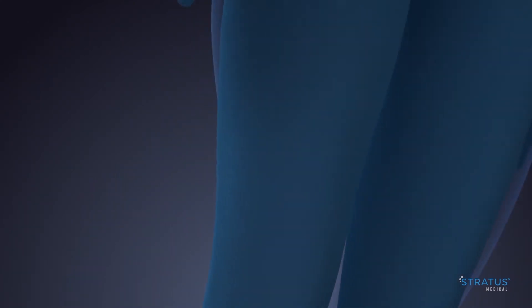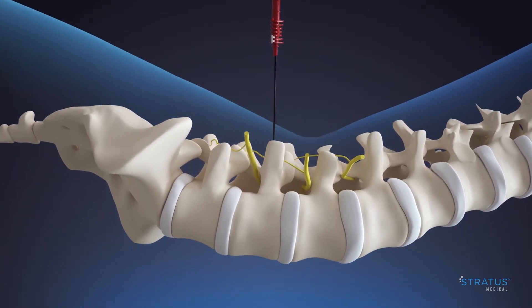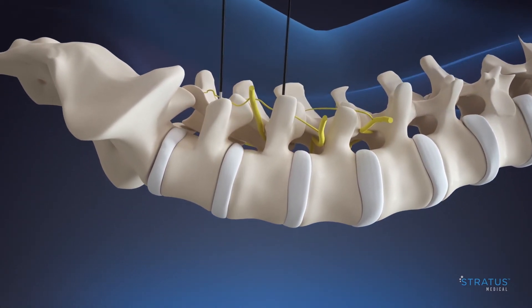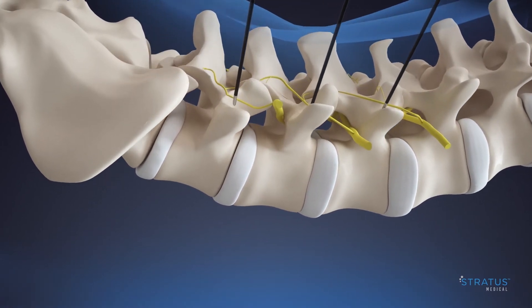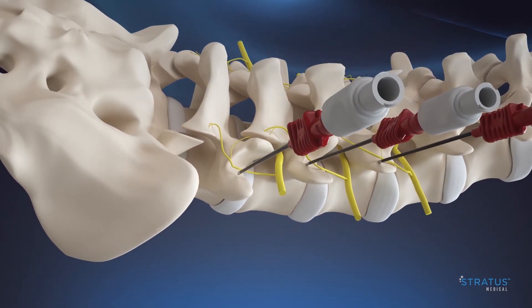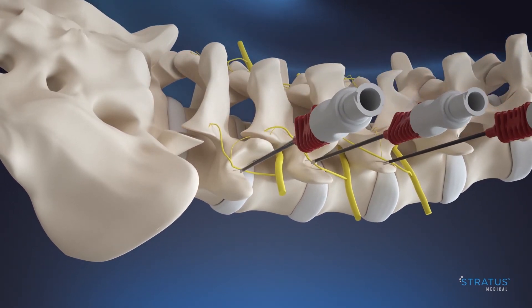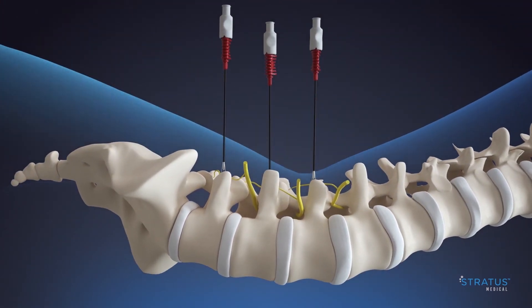Our physicians appreciate the simple perpendicular approach for routine RF scenarios such as lumbar medial branch. Insert Nimbus to the desired location using radiographic images to identify target anatomy. Twist the spin collar clockwise to deploy the expandable tines, noticing a tactile click when the tines are fully deployed.